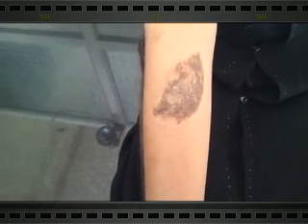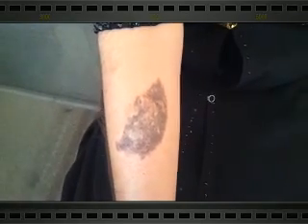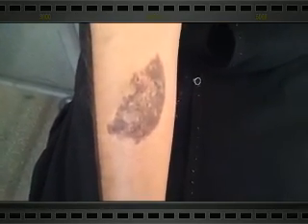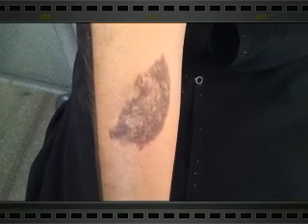This is the case of Becker's nevus. Two sittings of YAG laser have been done on this patient. You can see after the YAG laser, the nevus cells are removed and there is some normal skin appearance in the nevus area.